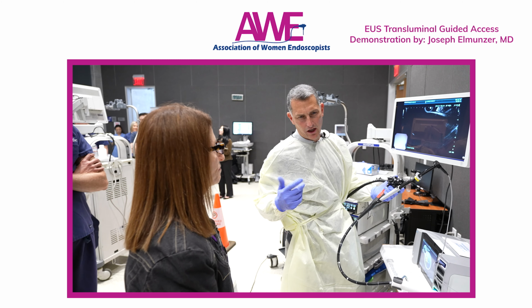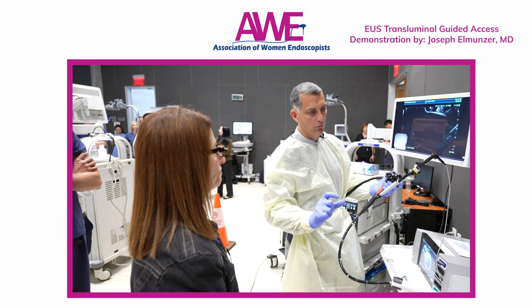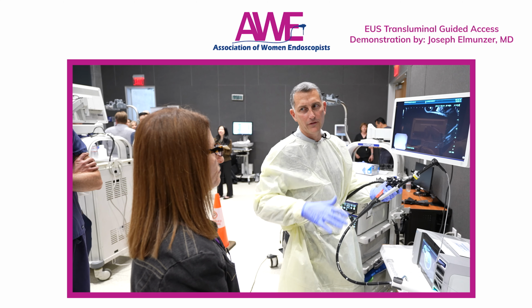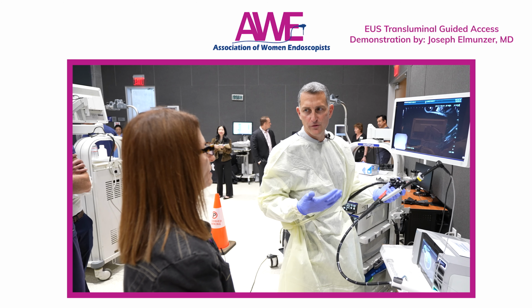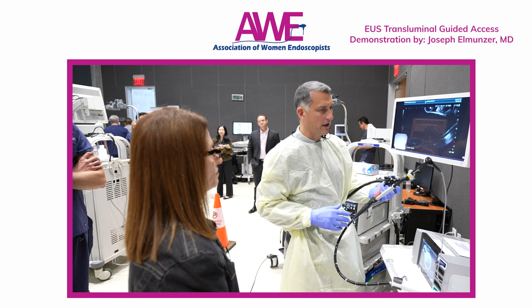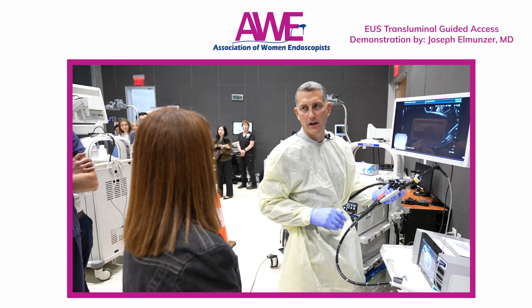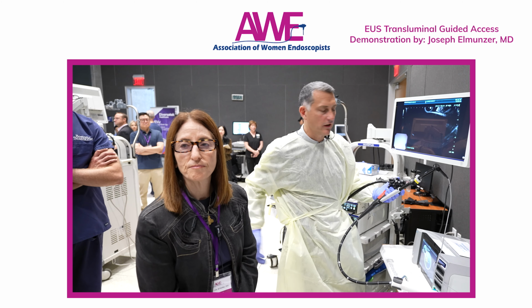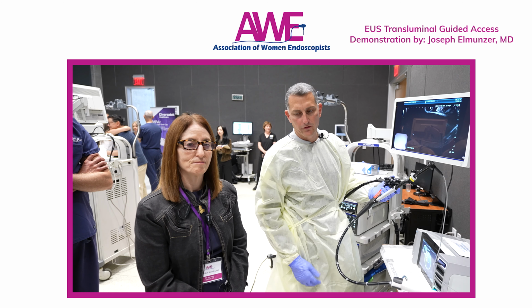I think that's the rationale behind the 15 millimeter length, to allow for a little bit more distance. But at some point, if it's super far away, you have to reconsider the indication and the judgment in general. If you measure beyond 15 millimeters, I think you have to think twice about the wisdom of doing that, and consider the risk-benefit ratio and so forth.